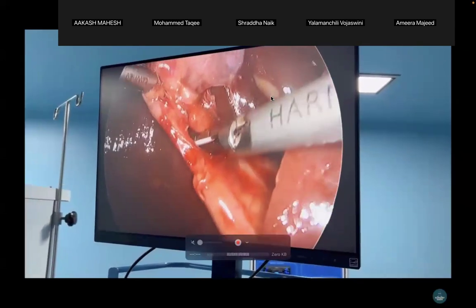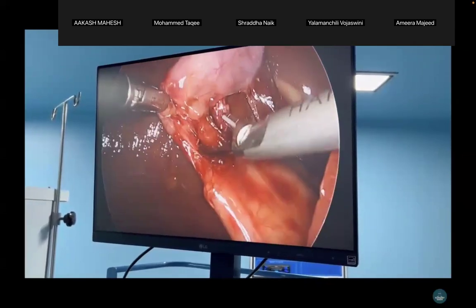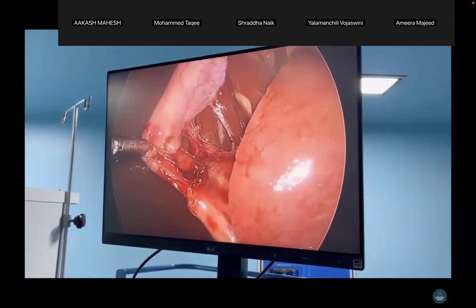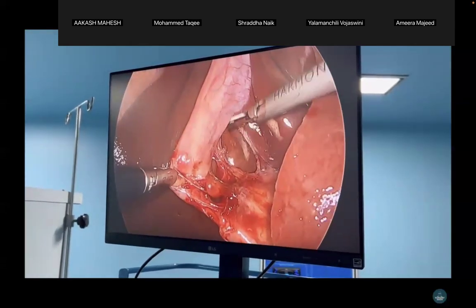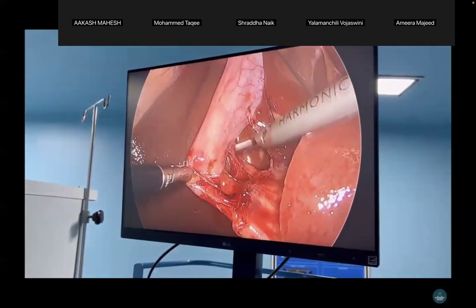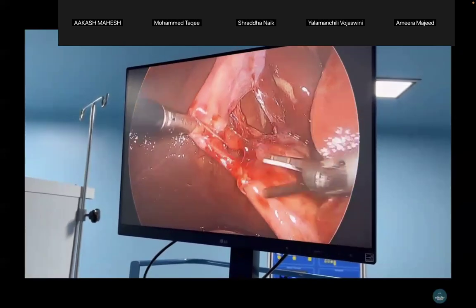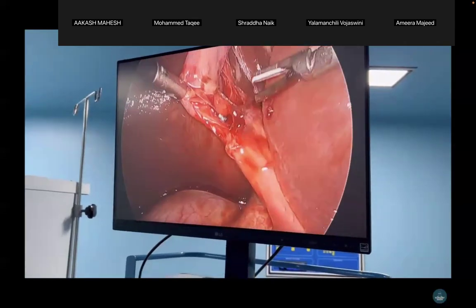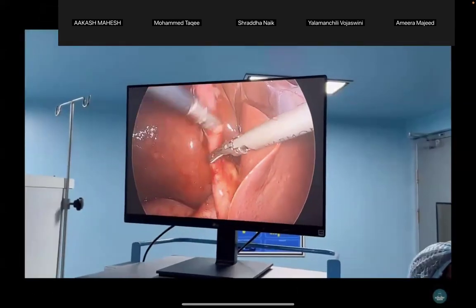But still, I have a doubt, because you can see a cystic lymph node going way ahead, and this is a structure of doubt. So I will take some more time and do some more dissection. It is a typical Lord Ganesha's view, everything is okay. But here we are getting two vessels. Can you see two vessels? Whenever you have two vessels and the posterior vessel is looking broad, always think that it's a Moynihan's hump. You will be surprised to see that in this case, we have a very short cystic artery. I'm demonstrating each and everything. It feels like everything is okay, everything is fine. Let me go and clip it.